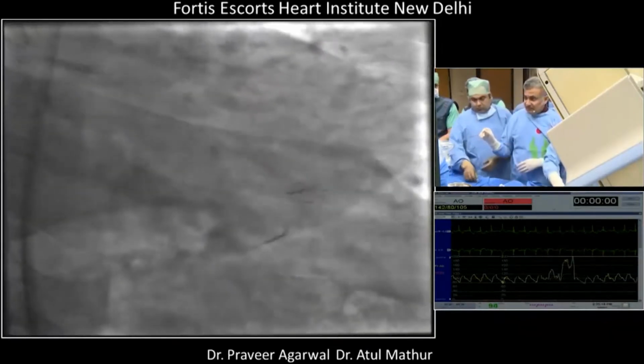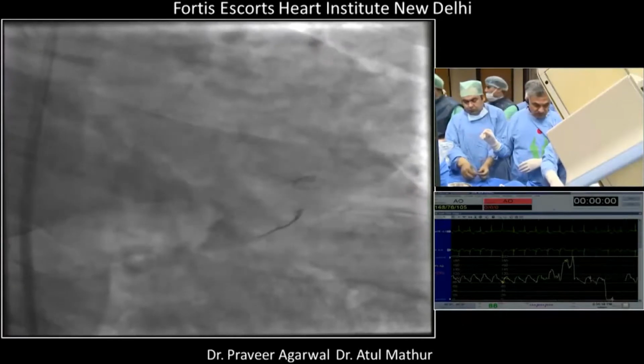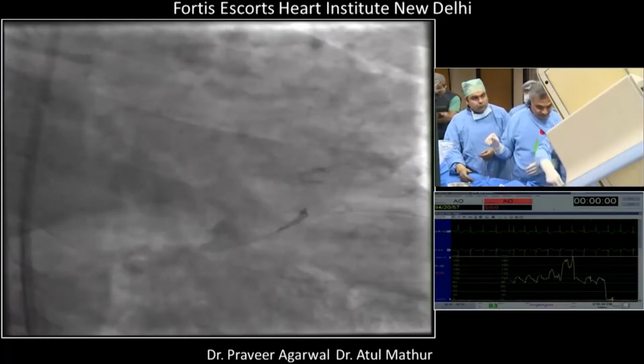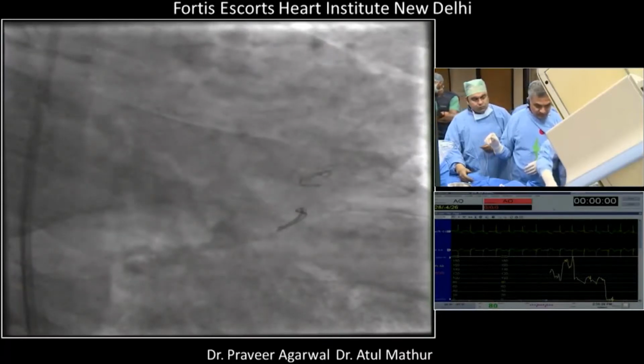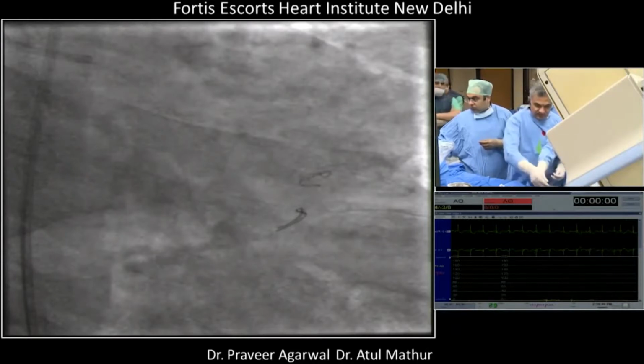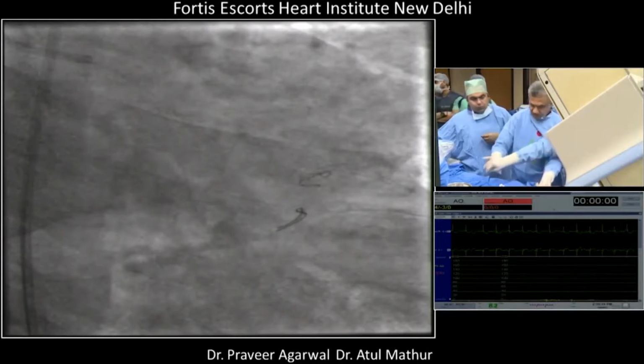अच्छा. Can we have 332? Wait, don't pull out anything. अभी नहीं. But जब instant place हो जाएगा, that time we'll take it out. Yeah. Wait, I'll give you. हाँ. No issue. All right. Okay.